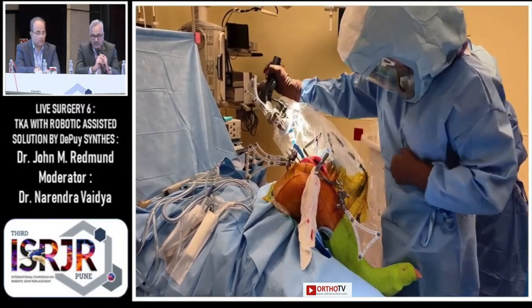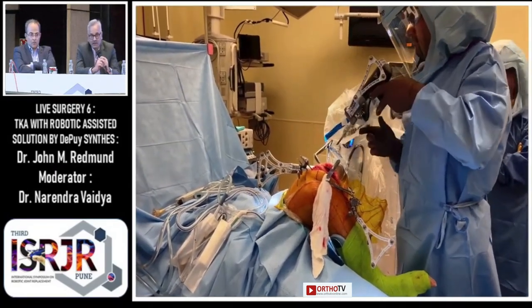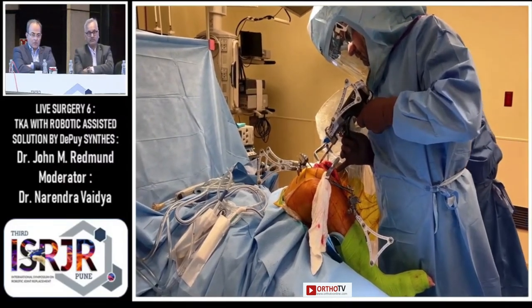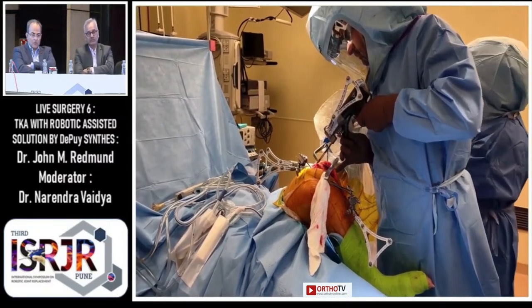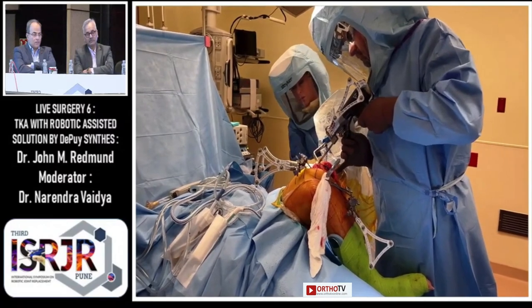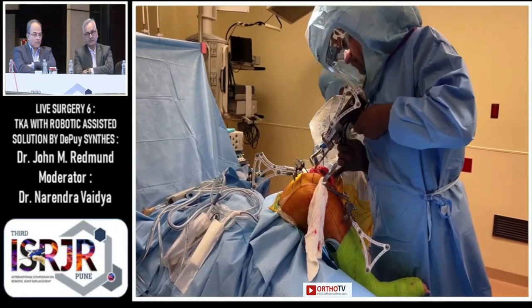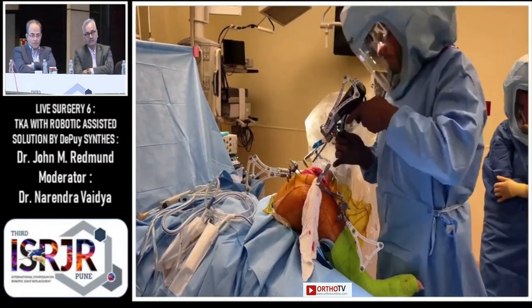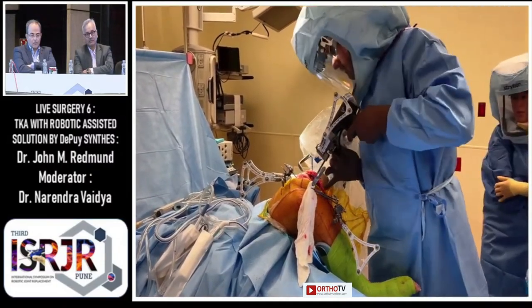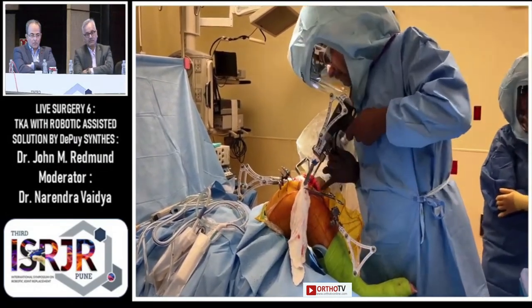It's planar-controlled but not haptic-bounded — there are no haptic boundaries because this is an imageless system. I've now made the distal cut. There's a foot pedal: every time you press it, the robot rotates the saw into the next cutting plane. After the anterior cut, I make sure my Z-retractor protects the medial collateral ligament.